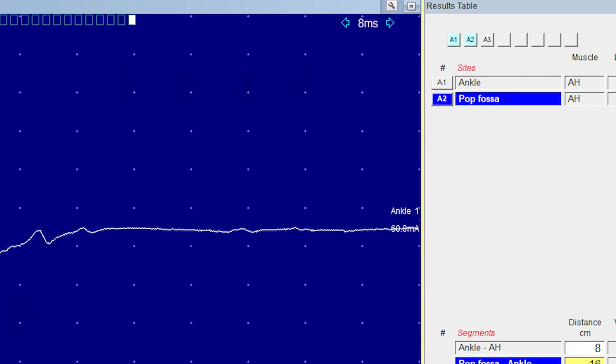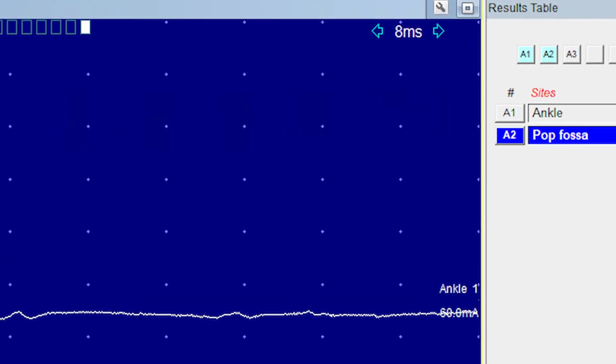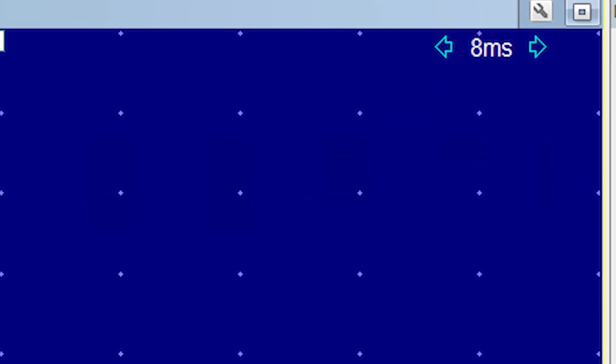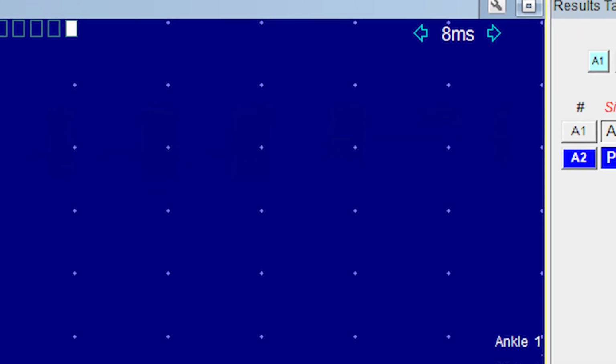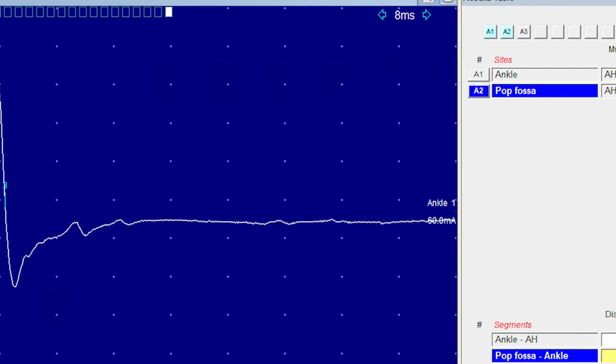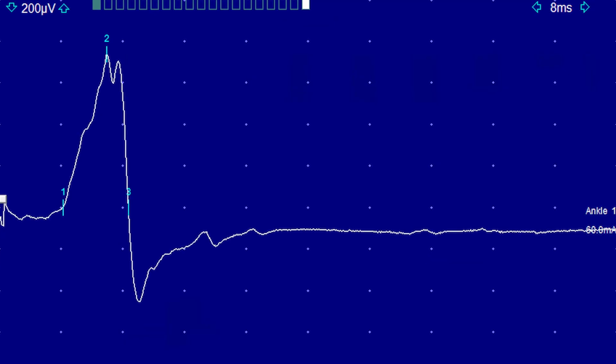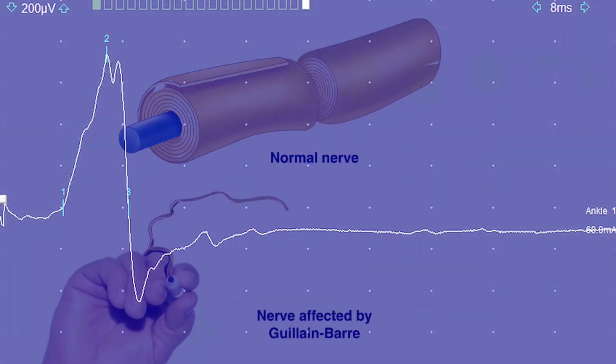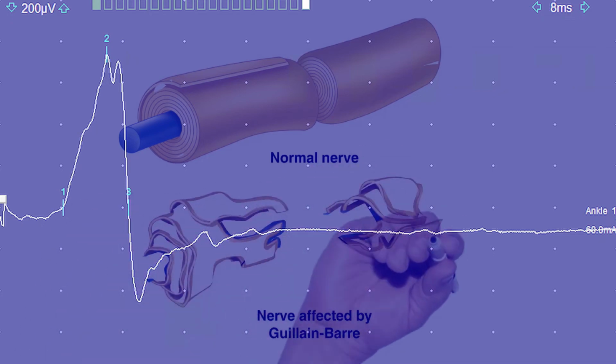To change the sweep speed so as to accommodate if this is further down, to see if you can compress and bring in those late signals caused by the demyelinating condition. So that has to be in the back of your mind. And same with the sensitivity. Because the signal is so low, the demyelinating process has caused so much damage to the nerve, you will not visualize it right away until you jack up the sensitivity.